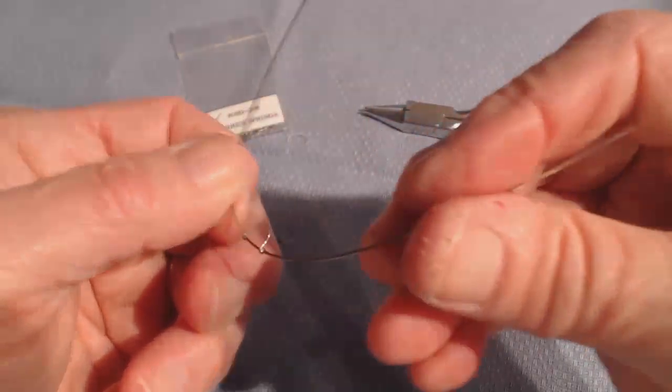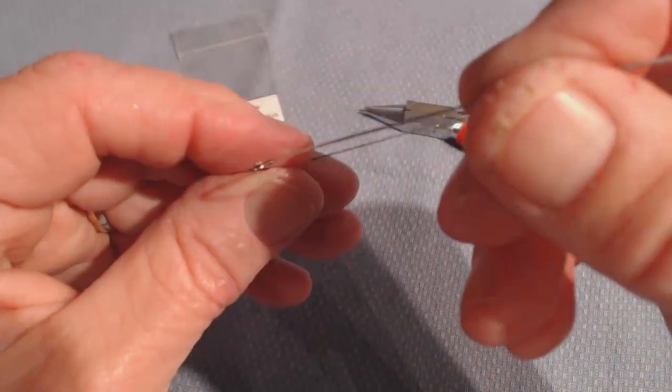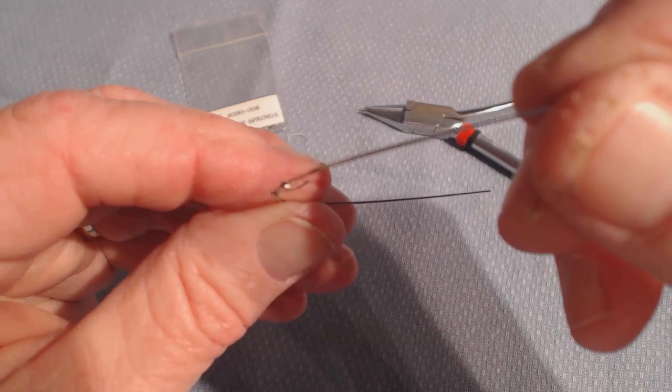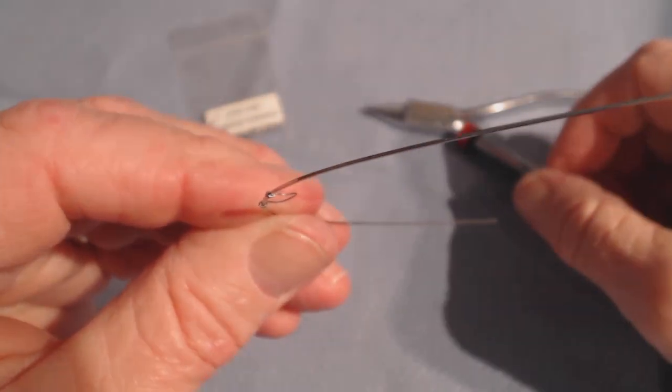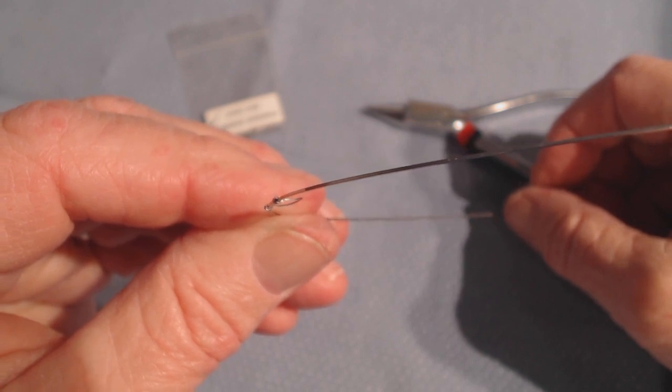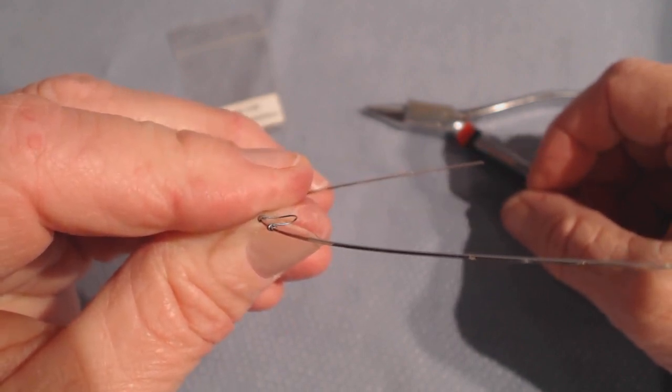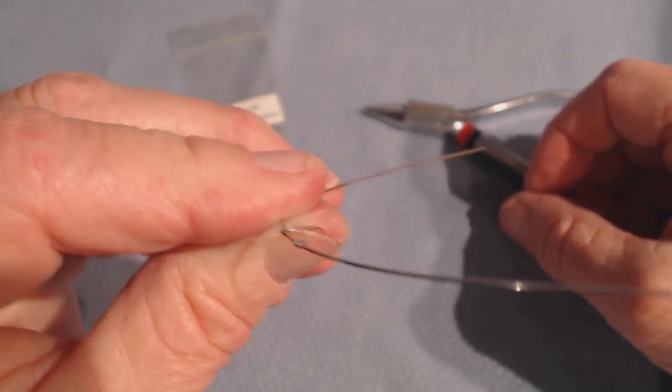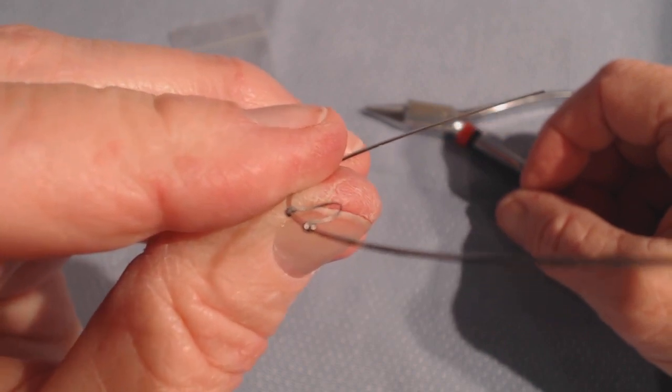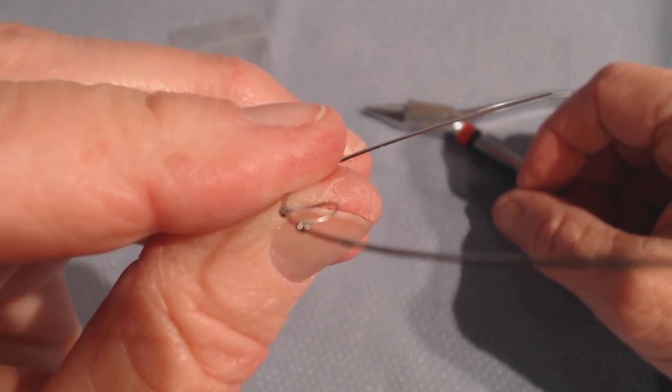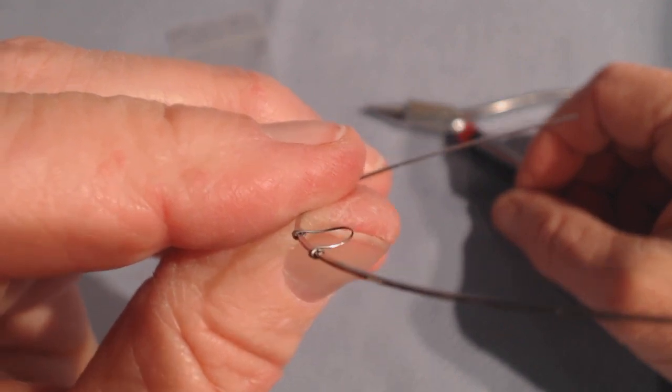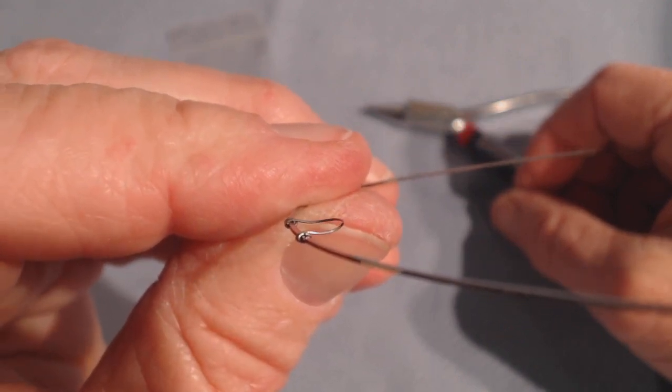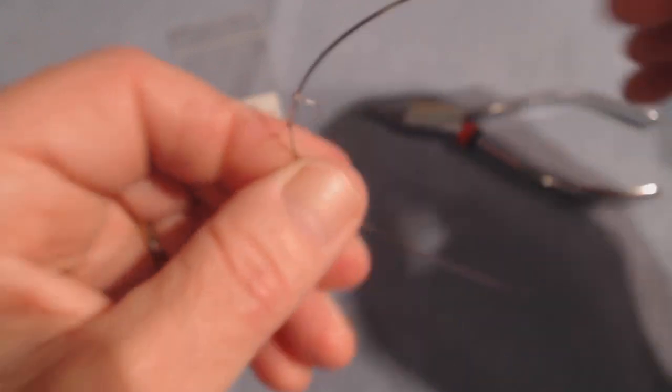And now let's look at the windings in more detail here. And then here in this position, I'm hoping that you can see if I push that spring up against the central incisor crown, that the windings would be winding tighter and not looser. And I've got this upside down, so let's turn it over.